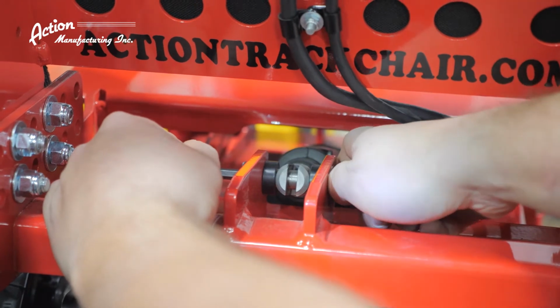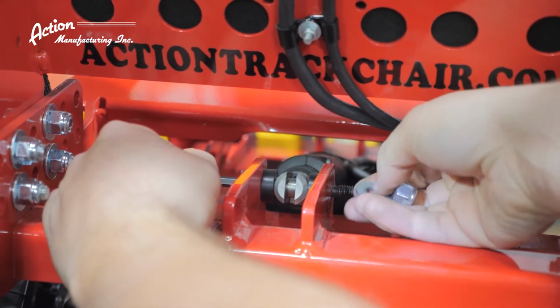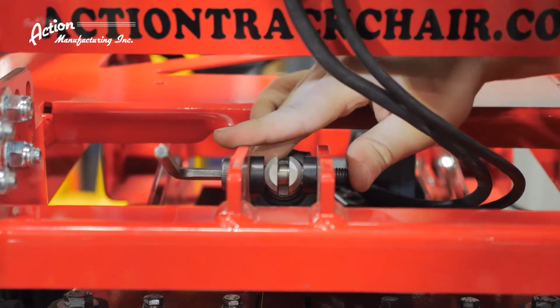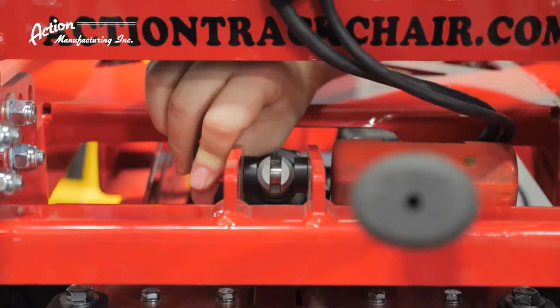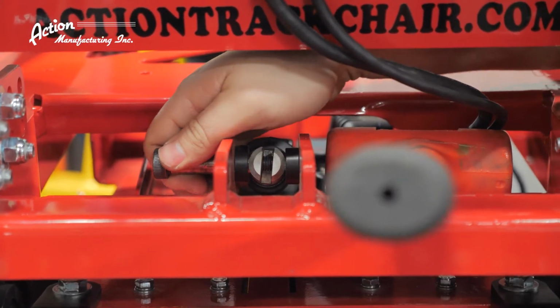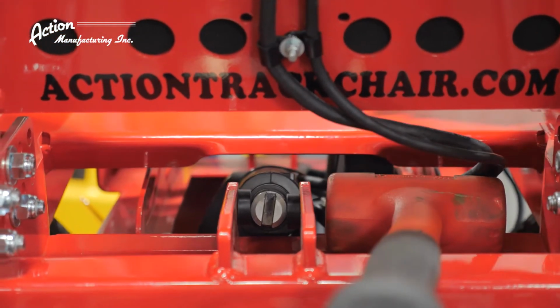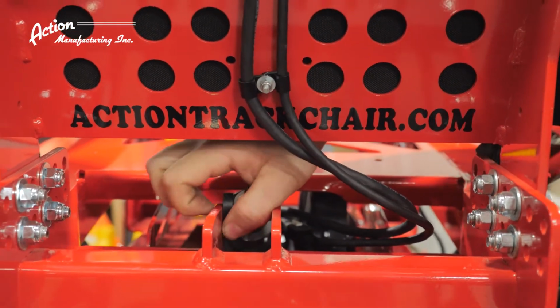We'll start by removing the bolt from the top rear of the actuator using the 1/4" Allen wrench and the 9/16" combination wrench. With the nut and washer removed, you may have to use a rubber mallet or a similar item to lightly tap the bolt out. As you do, keep track of the 2 black plastic spacers.